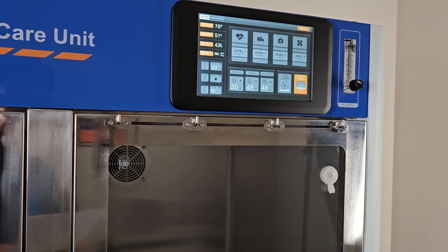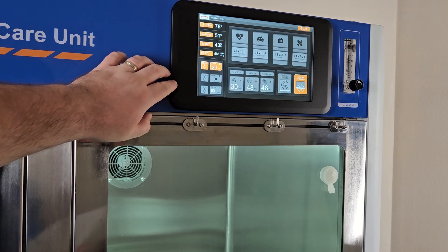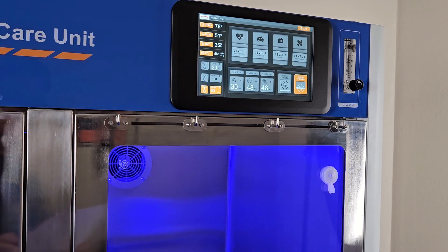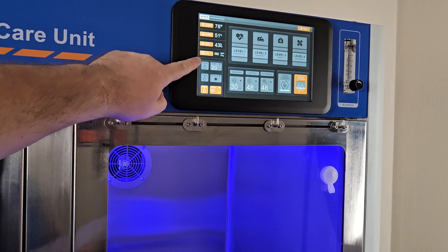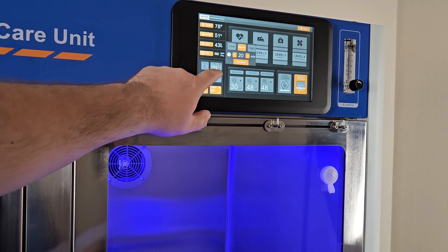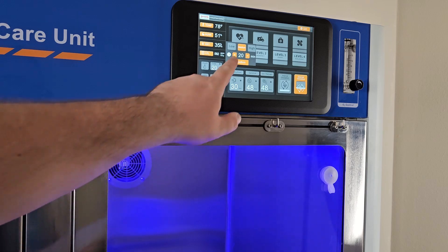Below these settings are controls for lighting in the unit. The unit can project white light, warm lights, or blue lights for therapy and wound healing. You can change the different types of light by clicking the bulb icons on the left. The setting box next to each light type will allow you to change the intensity of the light and the amount of time each light will automatically turn off. The white and warm lights can be set between 1 and 60 minutes, and the blue light can be set between 60 and 600 minutes.